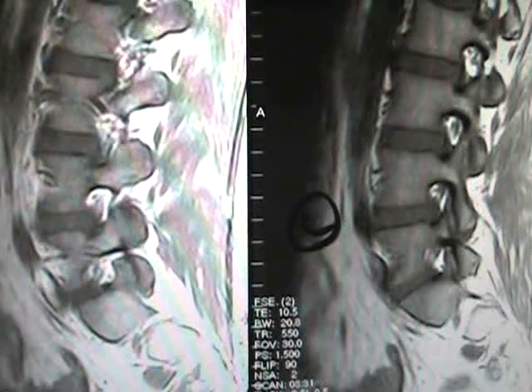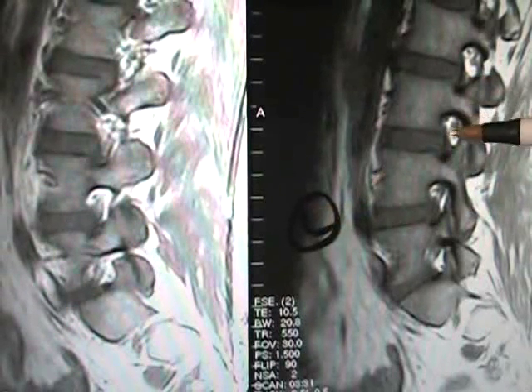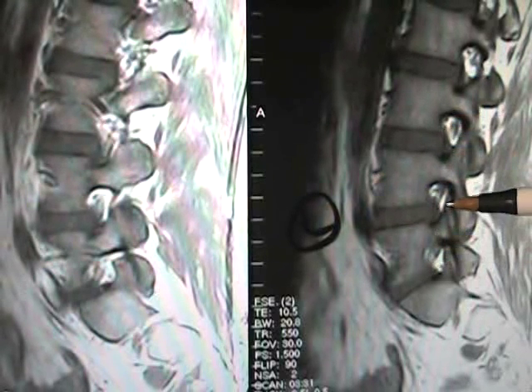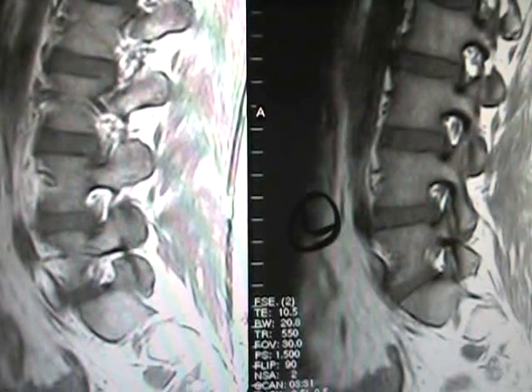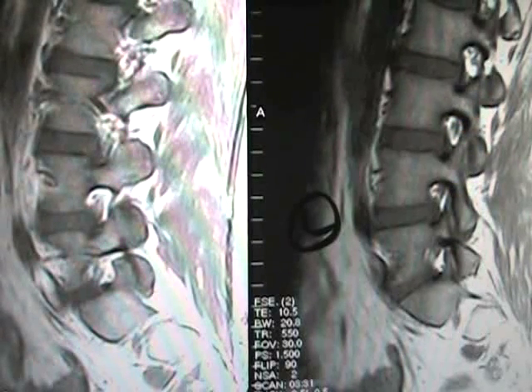This is a normal lumbar spine view through the facet joints and foramen. This is designated on the left, indicating the left holes are visible. So these are the foramens or holes at each level, and the little dark area inside the hole is a nerve root exiting through that hole. When we see white around the nerve root, as we see here, that's fat that surrounds the nerve root. And when we see fat that surrounds the nerve root, that indicates that the nerve root is not being compressed in the foramen as it exits the spine. We get similar images looking on the right side as well.